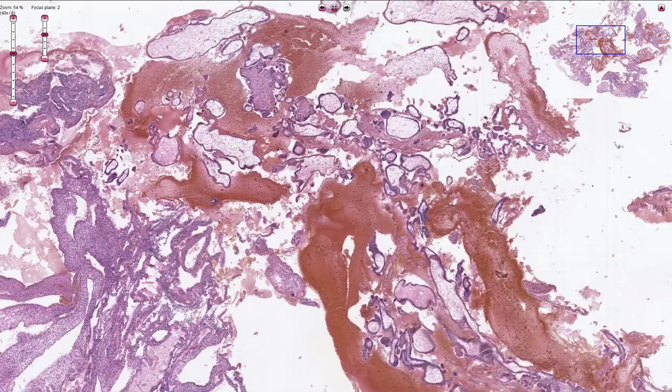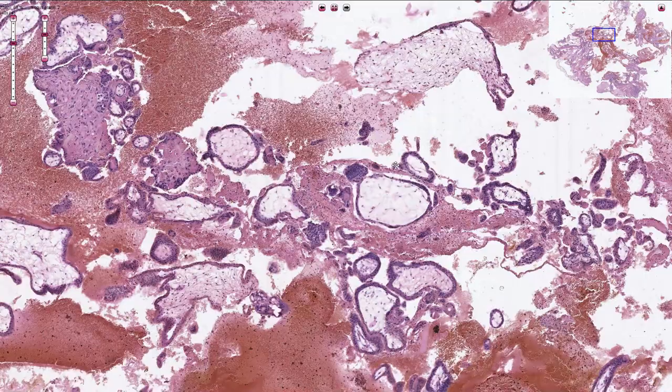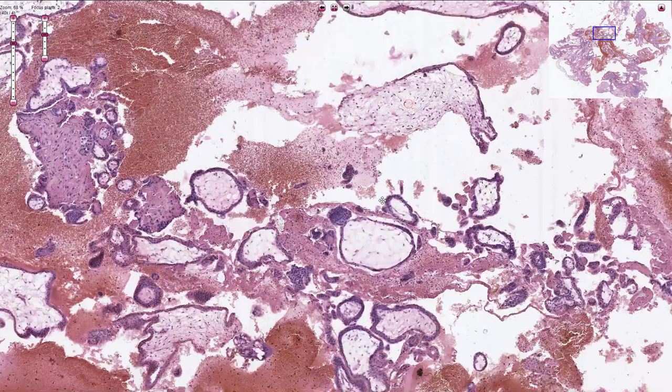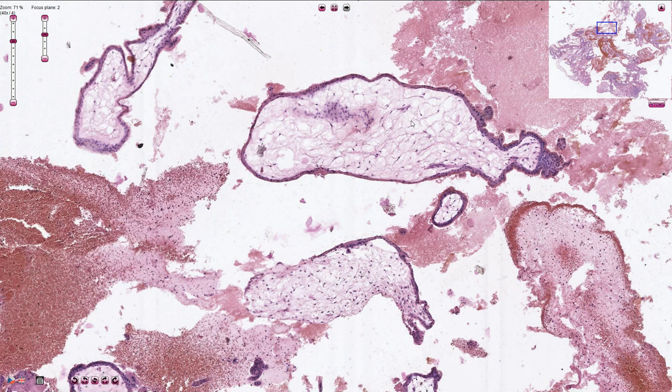On higher magnification we can see that all of these villi are quite immature and mesenchymal, some of them slightly hydropic and therefore larger. In the center of the chorionic villi we can see myxomatous stroma without blood vessels, which is the sign of immature trophoblast seen in the first trimester.